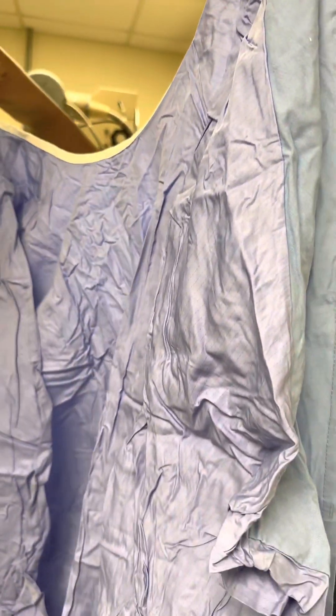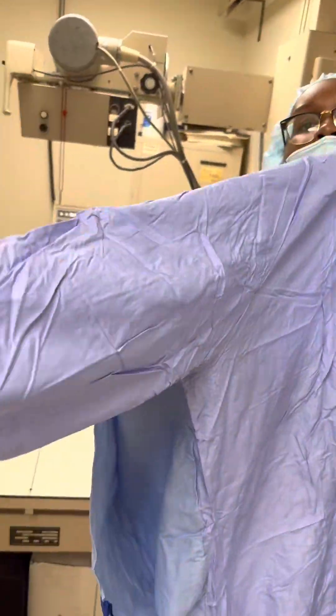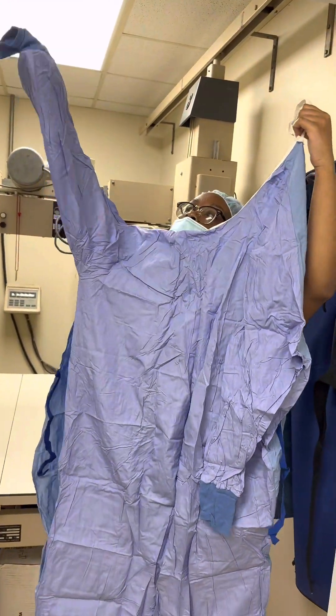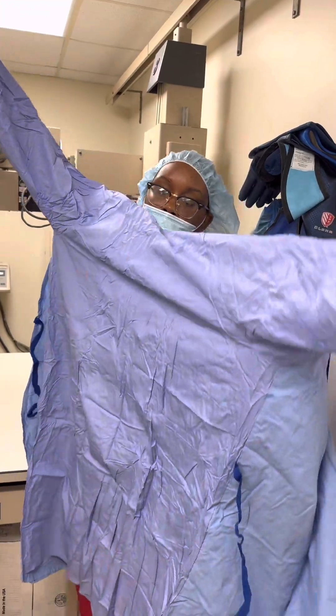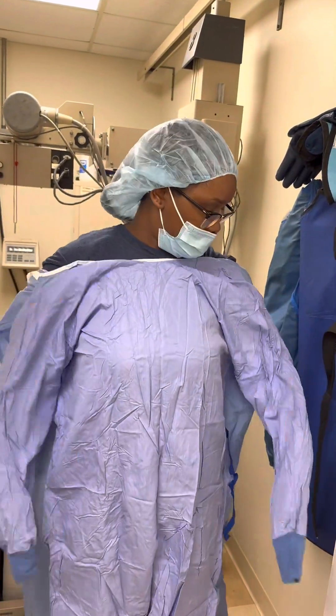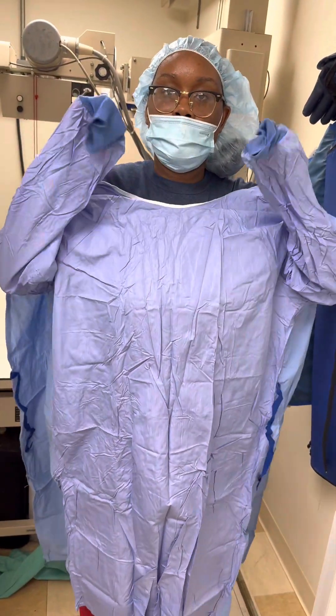So with one hand I'm going to hold it, and then with the other hand I'm going to slip in, and then slip in the other side. I'm going to keep my arms about right there so they won't extend past the cuffs.